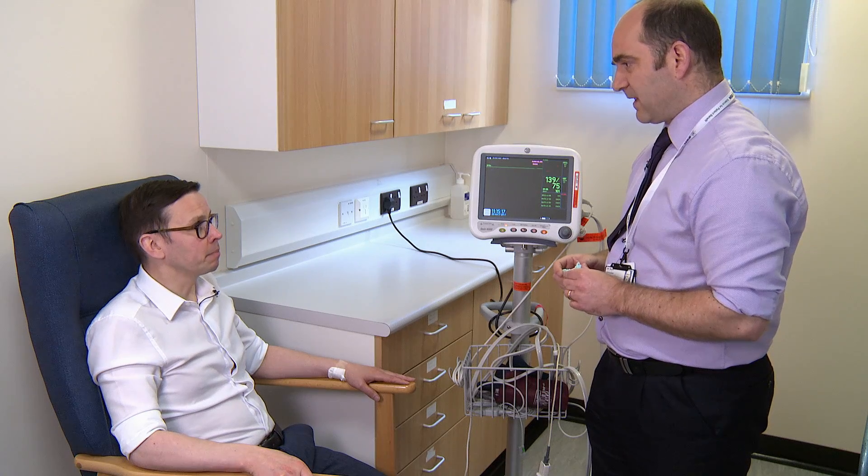If however everything's fine by the end of the test — we get to 20 minutes and your oxygen levels are okay — then that would suggest that you shouldn't need to take oxygen with you when you go on the flight. Does that all sound okay? Yeah. Lovely.